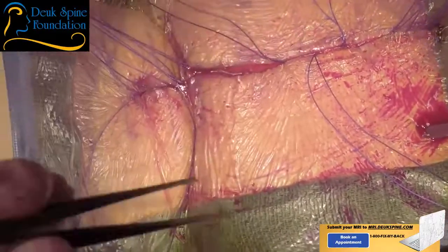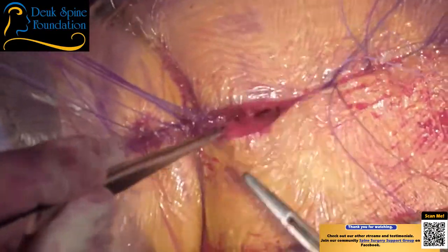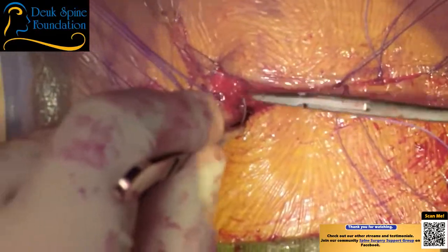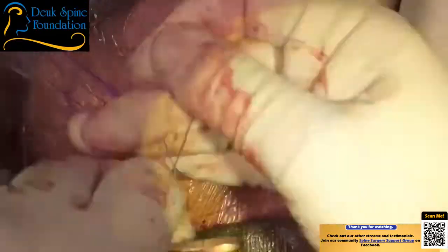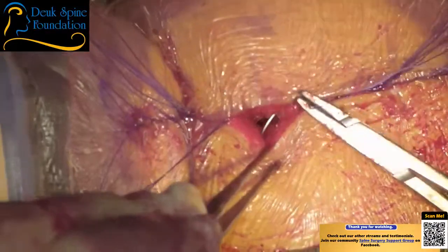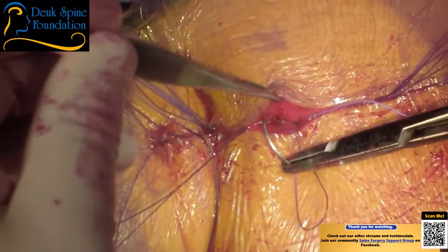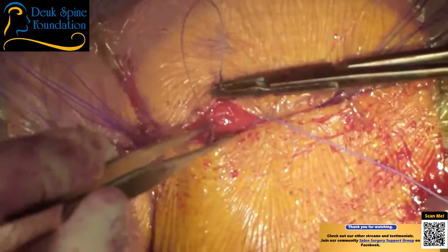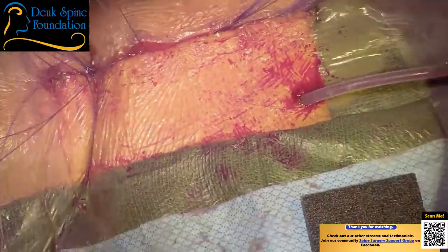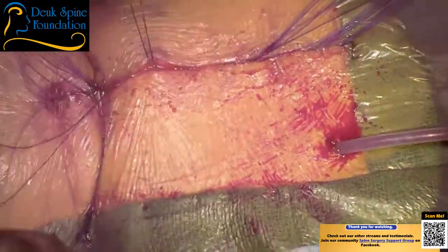We're almost done. We'll be stapled in less than 5 minutes. Yeah. Can you disconnect everything? Make sure that doesn't hit that tube. Stitch. How many more you got? We have 7 more, sir. Perfect. Go ahead. One more here and then a drain. I need a scissor. Heavy. I need a scissor next. I need one more stitch and then a heavy scissor.